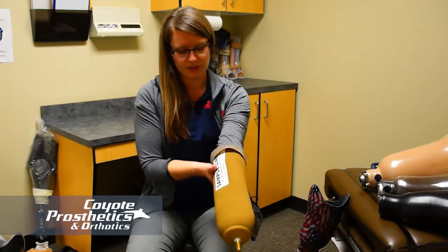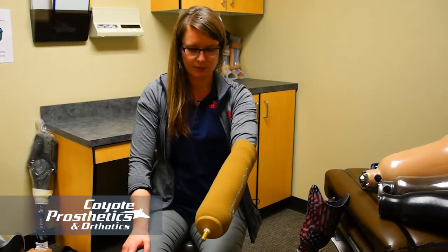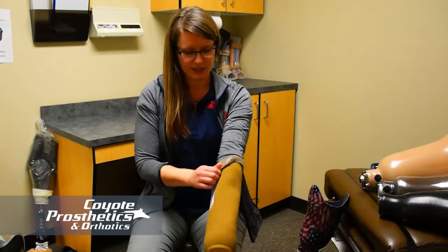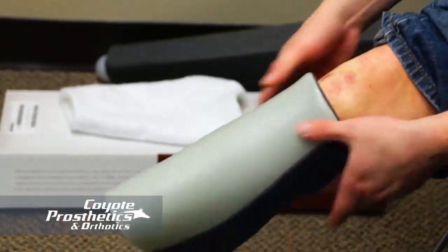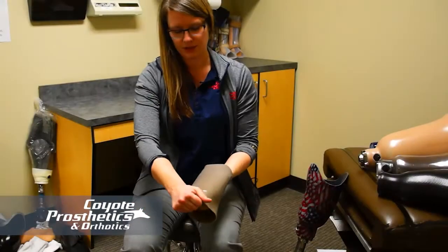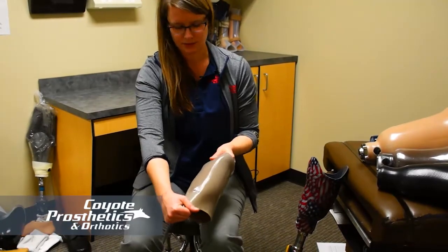And then you don't want to leave this doubled over. You want to make sure that you roll it all the way up. When you take it off, it's going to be the same thing. You just fold over the edge, and then use your hands to roll it down. What you don't want to do is pull on the edge. That's going to wear your liner out a lot faster.